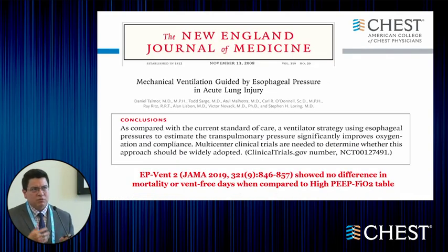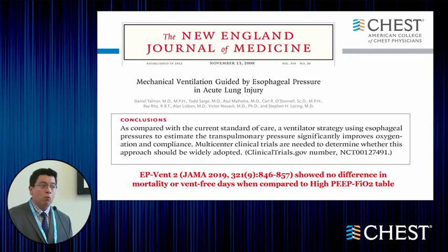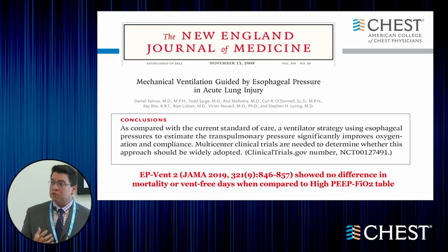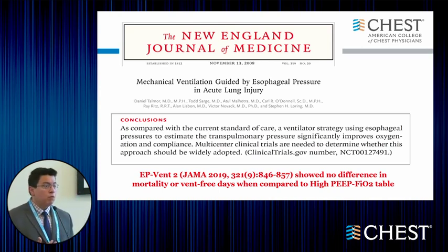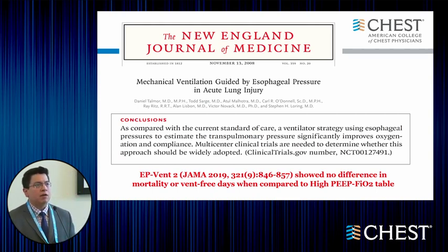This is what was tested in the New England Journal of Medicine trial, EPVent-1, showing that this method of using esophageal pressure may result in better oxygenation, but really wasn't strong enough to prove any kind of outcomes in terms of ventilator days or mortality in patients with ARDS.